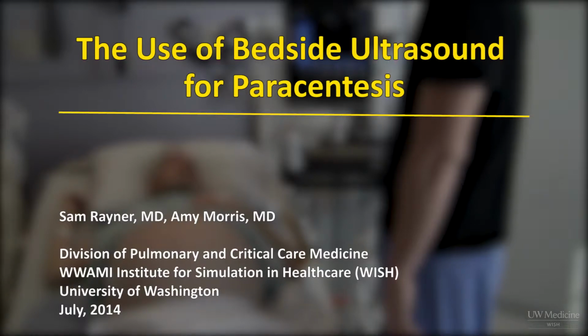Welcome to the University of Washington Internal Medicine training video for the use of point-of-care ultrasound for bedside paracentesis. This video will describe the use of ultrasound in performing this procedure, and the technique for the procedure itself is covered in the following modules.